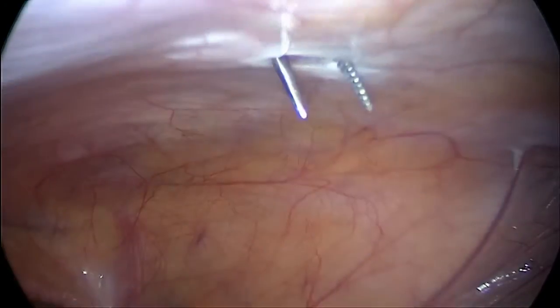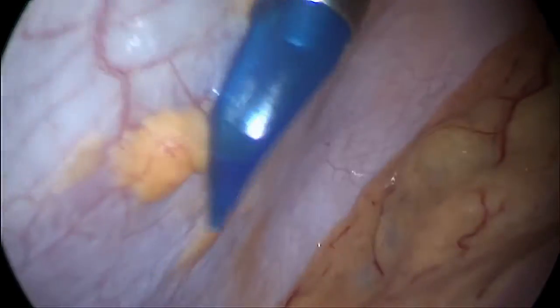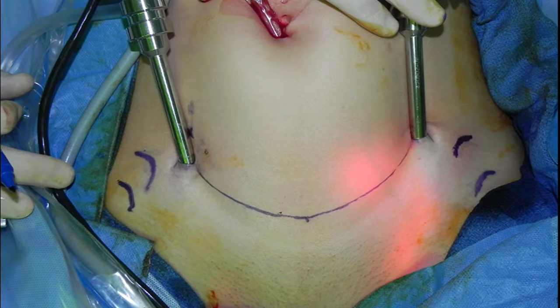The abdomen is insufflated via the umbilical port while the robotic trocars are inserted. As always, care is taken to identify the inferior epigastric arteries at the time of port placement. Final port placement is shown, with generous spacing preserved between working and camera ports, and also between the lateral working ports and the ASIS.